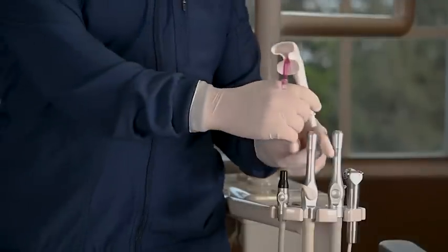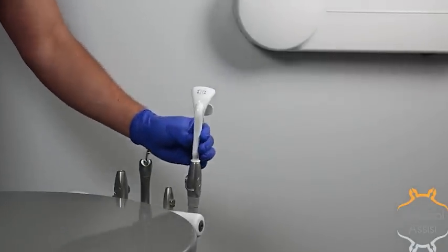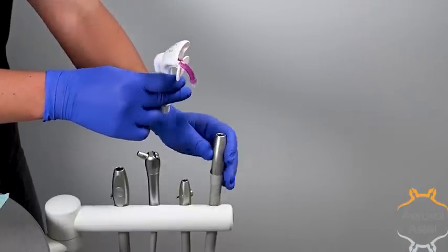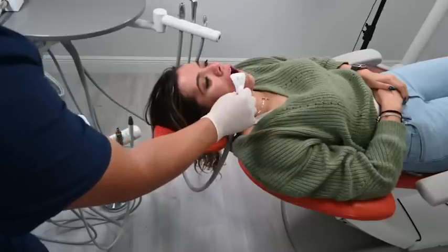The Aerosol Assist is designed to fit a standard HVE connector. If the Aerosol Assist is not snug when you place it on the HVE, the O-ring is probably missing or needs to be replaced. Missing or damaged O-rings are common and cause the Aerosol Assist to not attach. Visually verify that the O-ring inside the HVE is intact to ensure you are ready to install the Aerosol Assist.